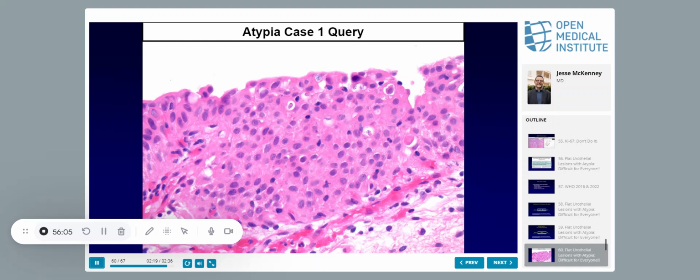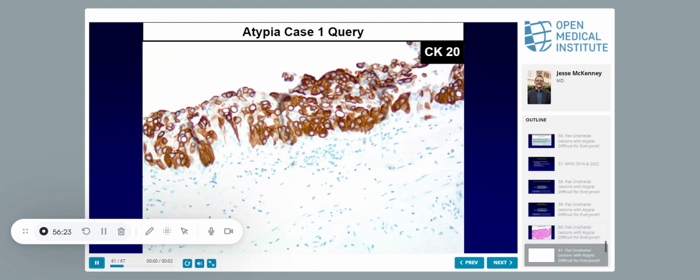It's very jumbled, and there's a lot of cell variation, and it's very pink. To me, this is very abnormal. I would be uncomfortable just saying this is classic reactive. It's very unusual. Plus, where's the acute inflammation? Okay, so anyway, in my thresholds, this is atypia of uncertain significance. And this isn't going to change my mind.